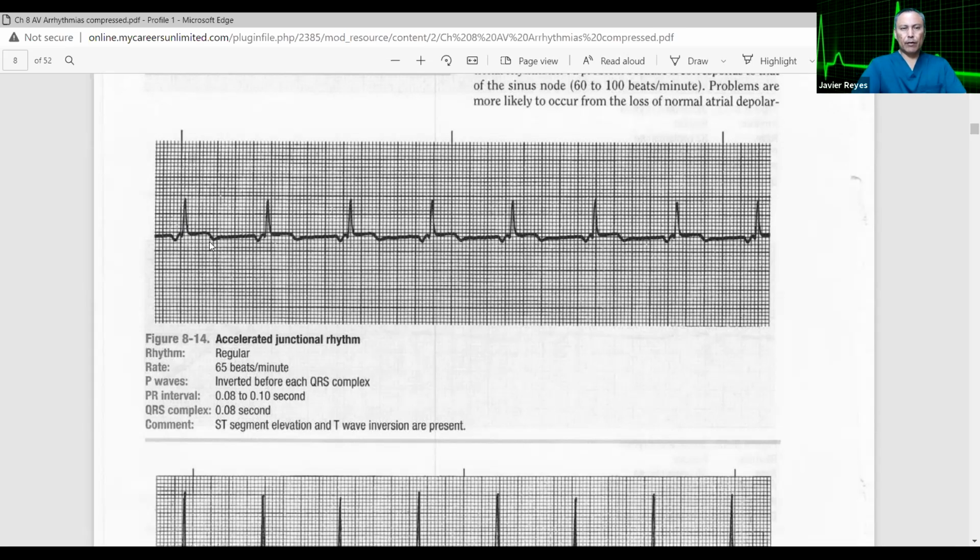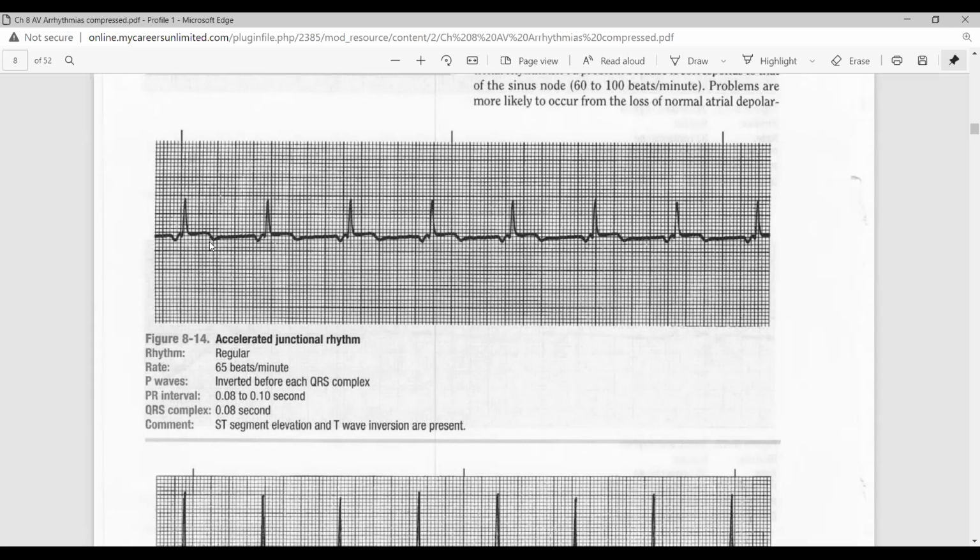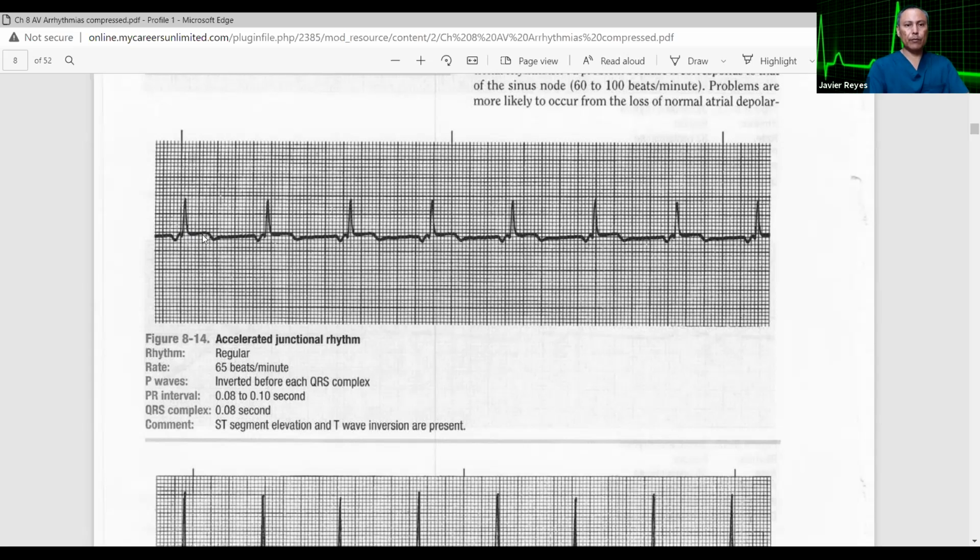It looks like a little chair, right? Have you ever seen a tombstone from the side? Yes? No? Okay. Well, in cardiology, we call this a tombstone because what it means is that the person is probably likely having a heart attack. There's tissue dying. So it's kind of related with death.